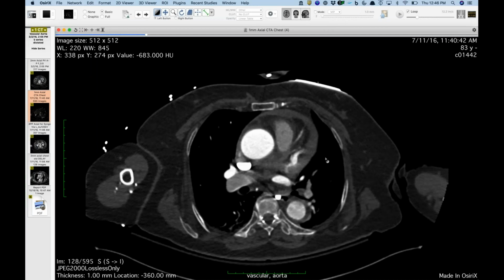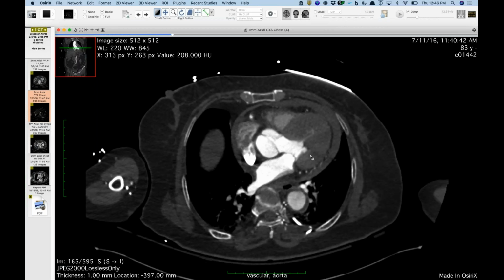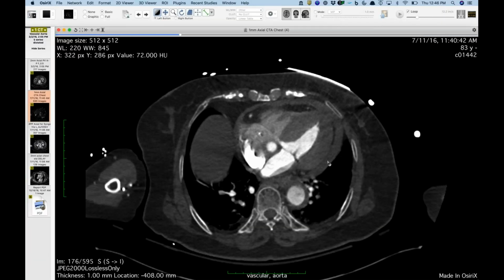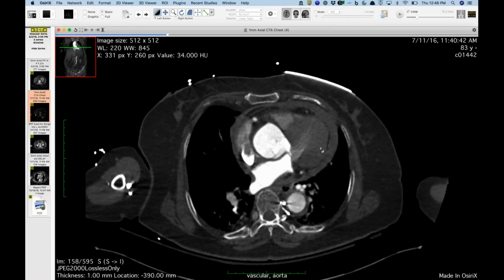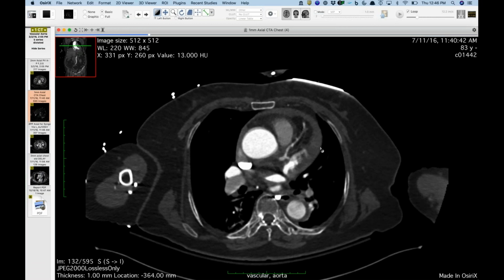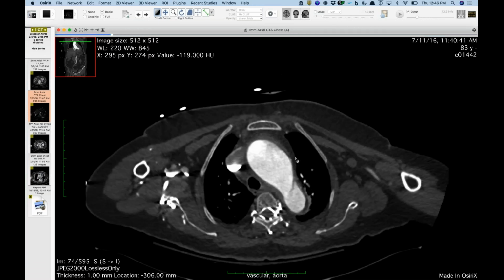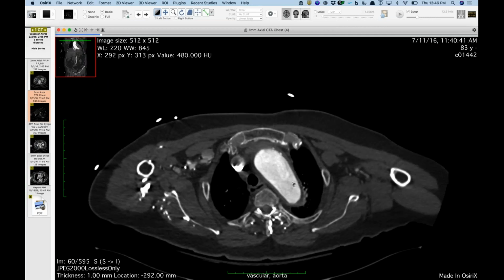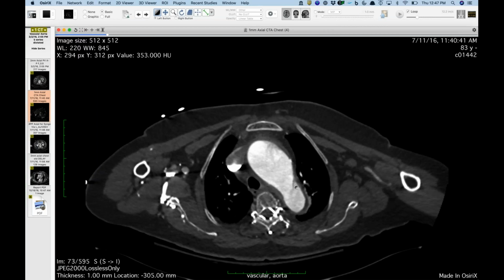And the other thing I always look for is myocardial rupture as a cause of hemopericardium. And there was no source or no sense that the patient had a ventricular aneurysm or pseudoaneurysm that ruptured. So they went in and evacuated the blood, and they described it as a lot of old clotted blood. So it doesn't even sound like it was that acute. But then what they did find was, in this area of the undersurface of the arch, what looked like a little penetrating ulcer that probably had been the source of bleeding.